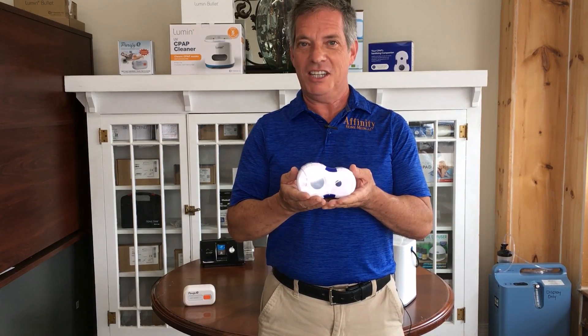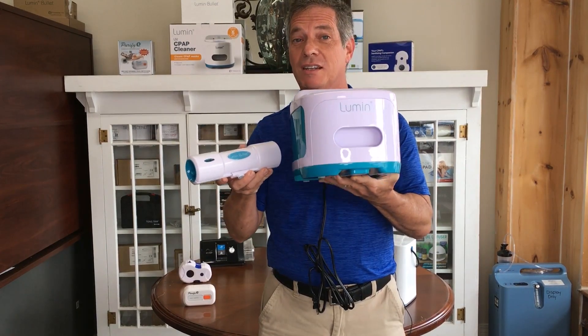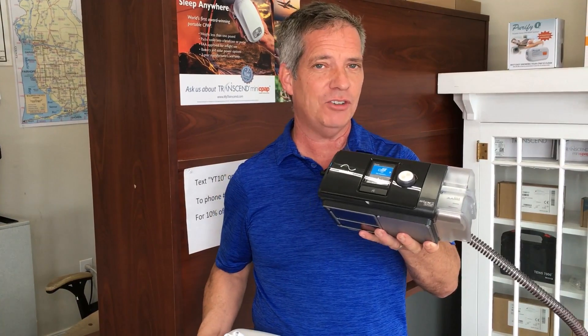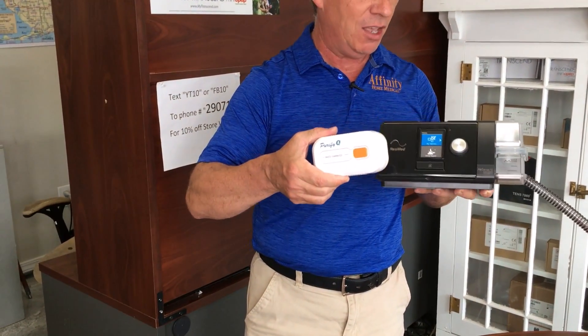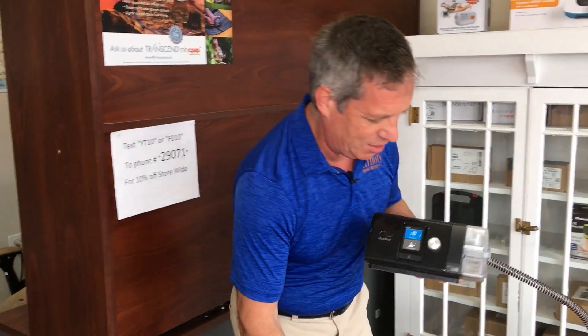The Purify O3, the Sleep 8, the Lumen, and the Lumen Bullet. We're going to start off with the AirSense 10 and the Purify O3 combination. So let's just go ahead and check it out.